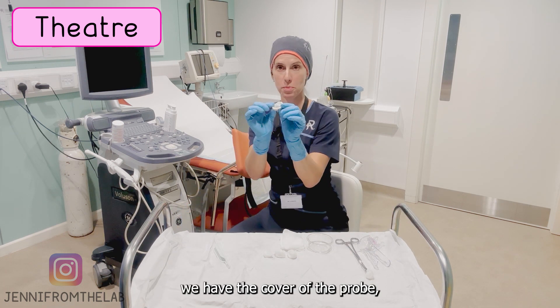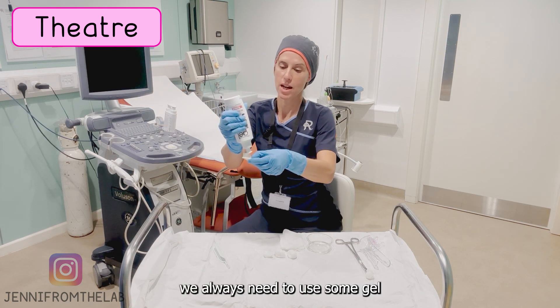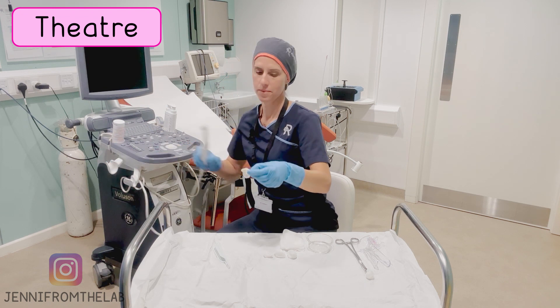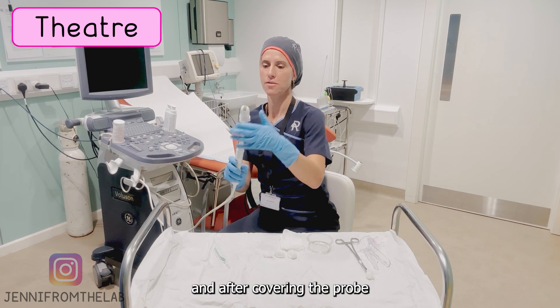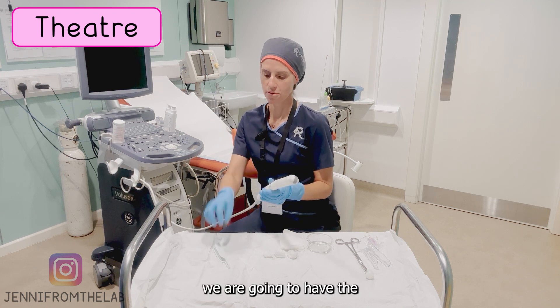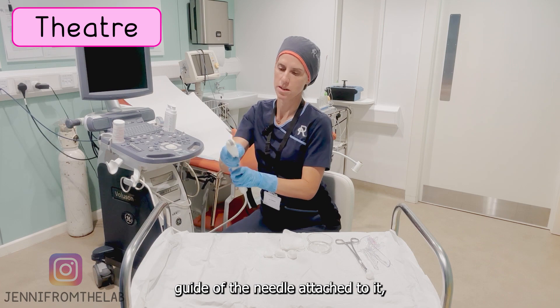We have the cover for the probe of the scan — we always need to use some gel that helps us to have a good view. After covering the probe, we attach the needle guide to it so it doesn't move.